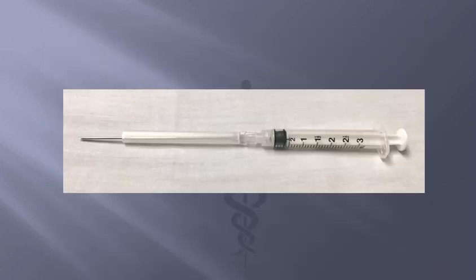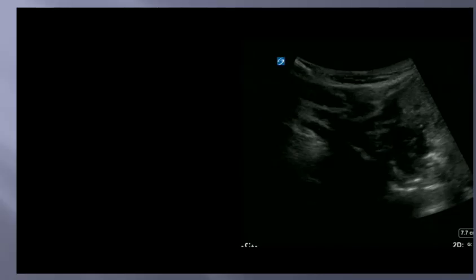You can cut your needle sheath appropriately for the abscess and the artery. And then if you wanted to skip the ultrasound at that point, I think that would be a completely reasonable thing to do. You know where the artery is, you know where the abscess is, you know how deep it is. So you could go in with landmarks at that point, but you can also use the ultrasound for real-time guidance. And that's what we did here.